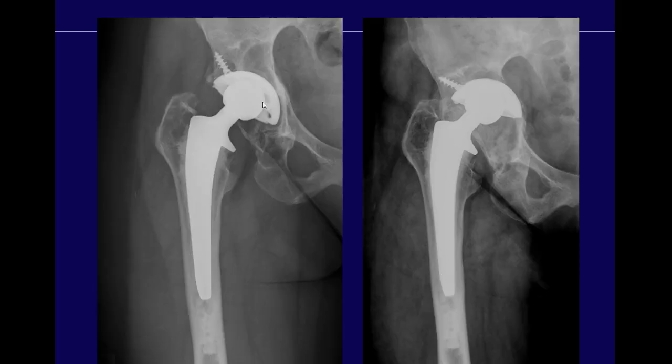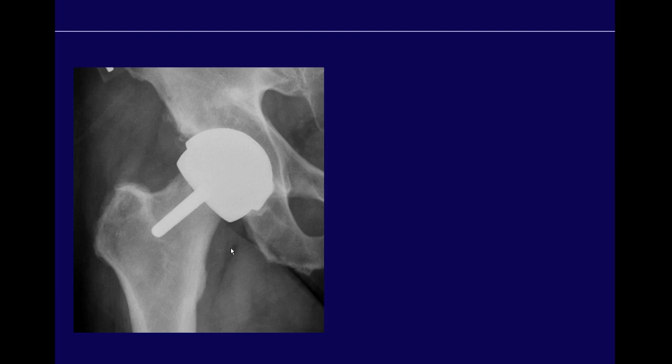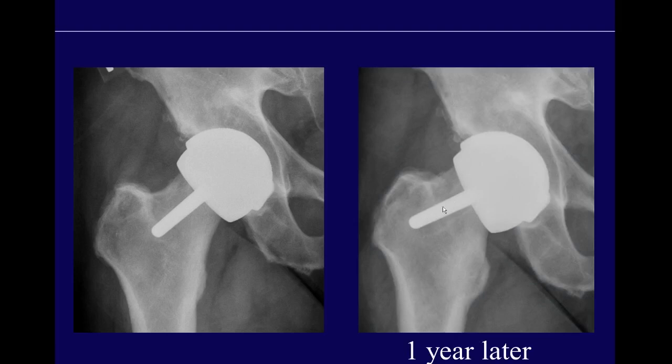Here's a patient with a femoral component where the head sits asymmetrically — indicating polyethylene wear — with large areas of osteolysis. A year later, the prosthesis has changed position and a screw is loose, confirming the component is loose. In another patient, the stem is in neutral with wide radiolucency and osteolysis in the lateral cortex; eight months later it has shifted from neutral into varus. Any change in position of the component tells you it is loose. Hip resurfacings can also become loose — here a shift in position over one year with a subtle radiolucency around the peg confirms loosening.